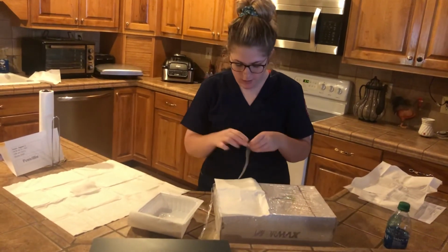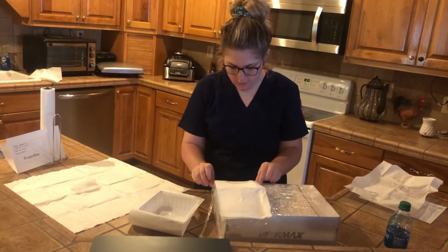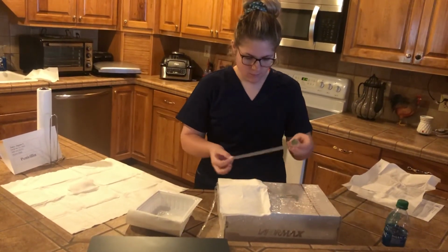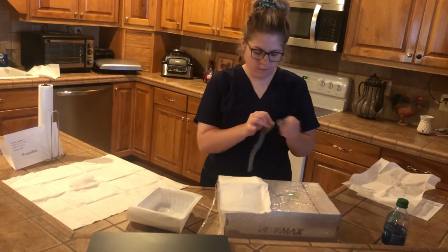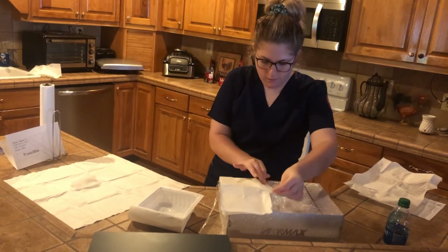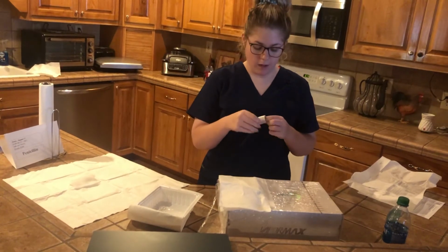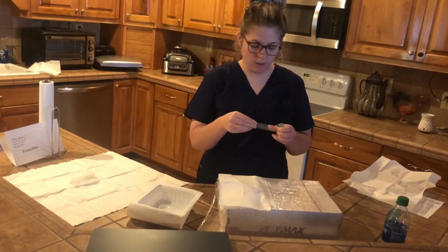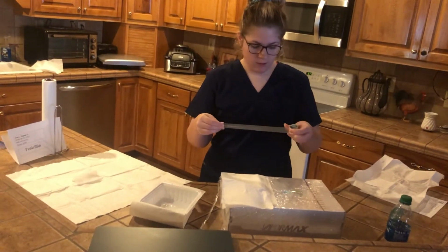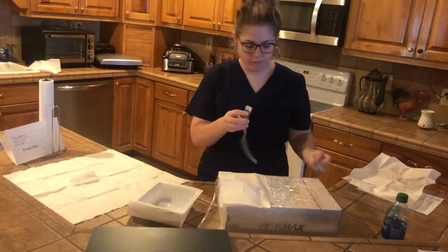Measure the tape, tear it, and apply to the dressing. I am running out of tape, however, normally in a hospital setting, I would just have another roll of tape with me that I could use.